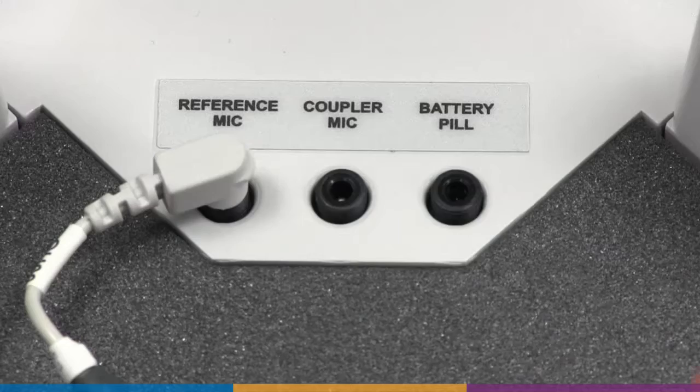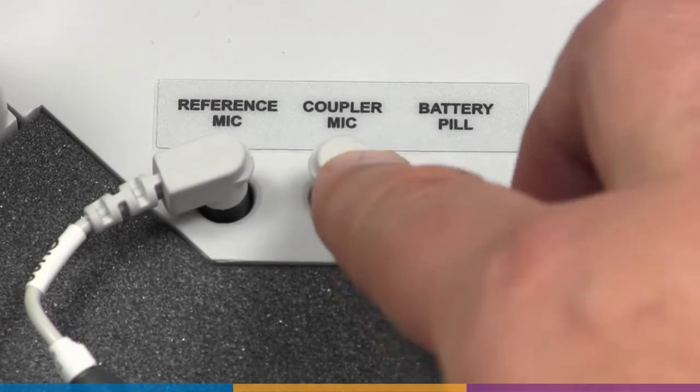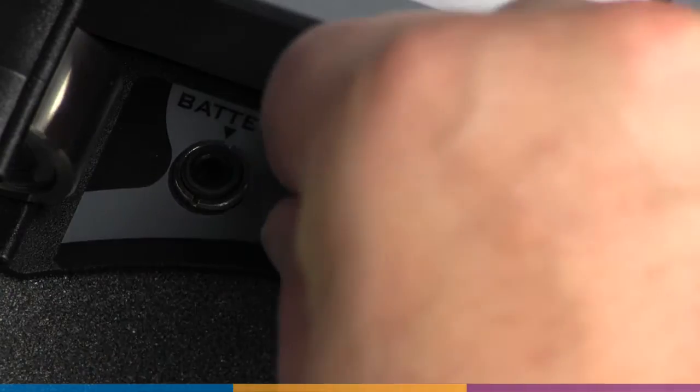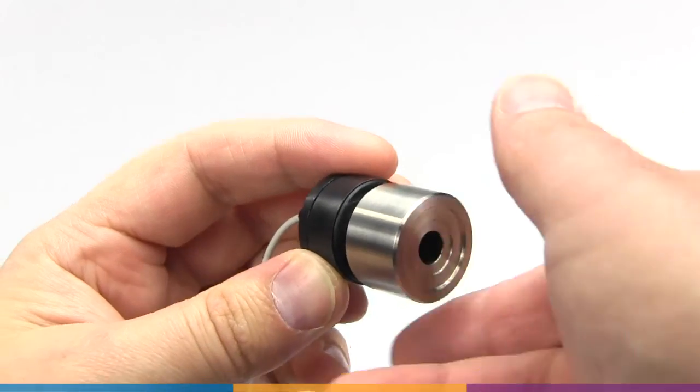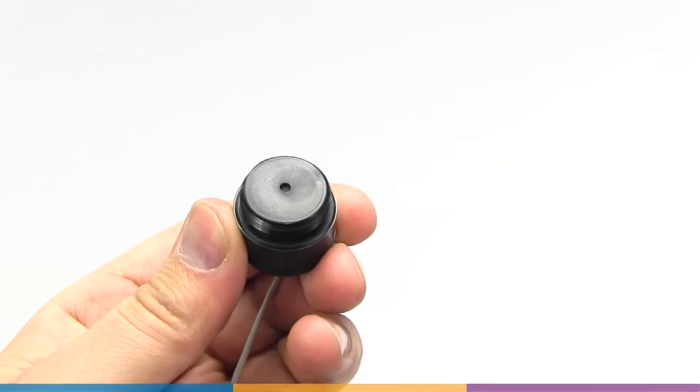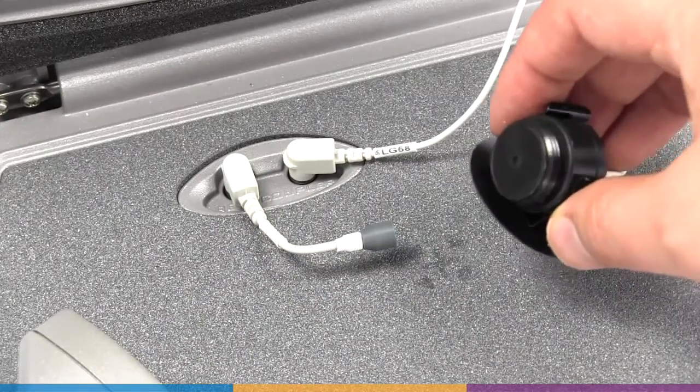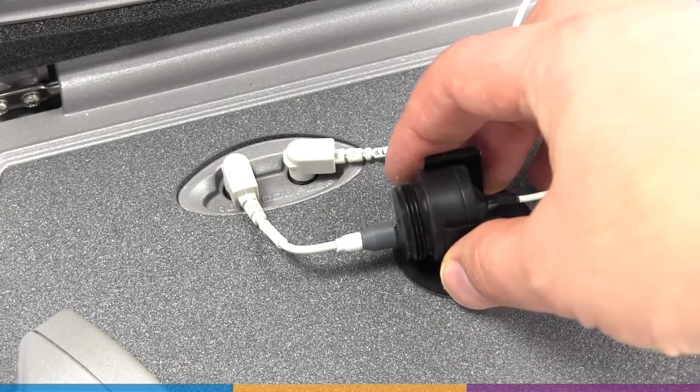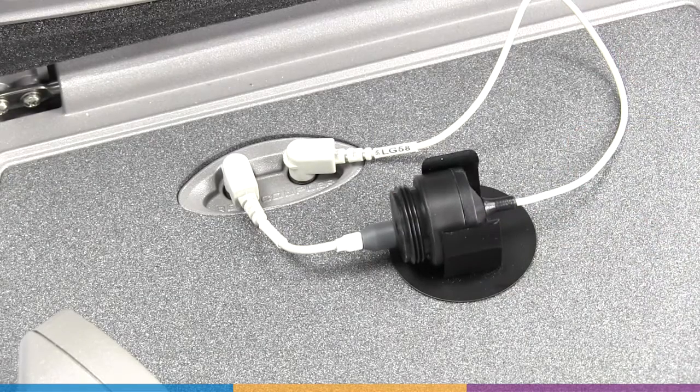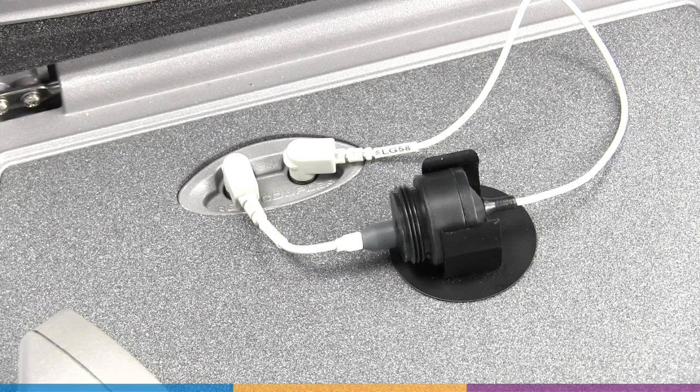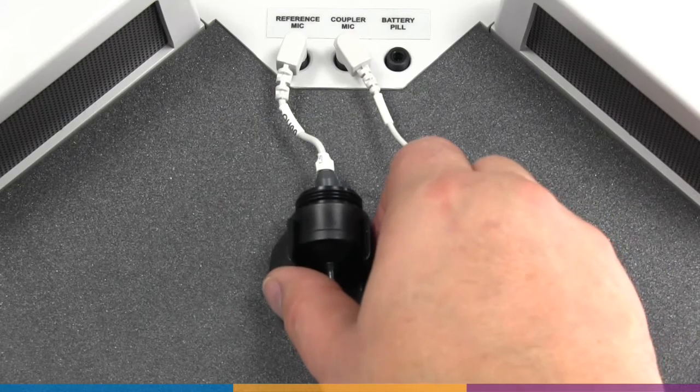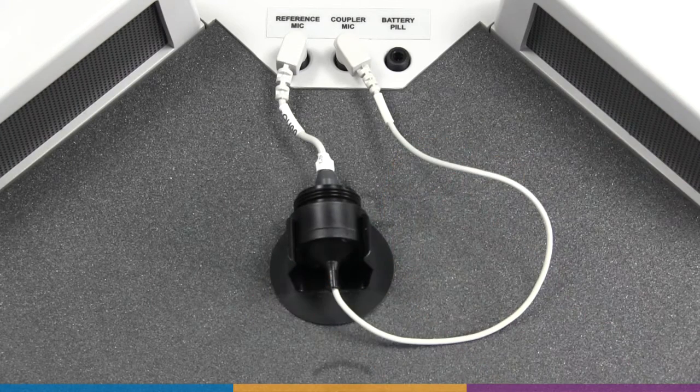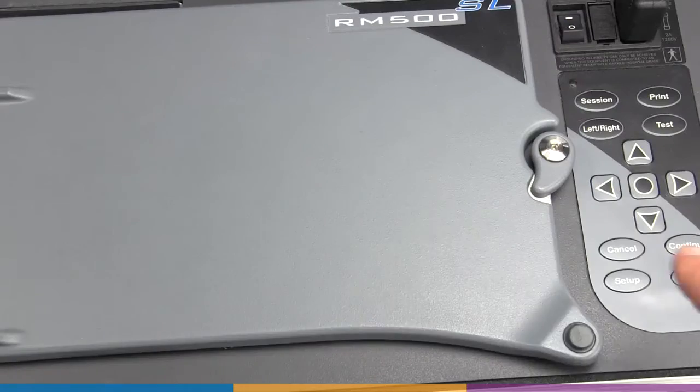If this is your initial setup, see the user guide for detailed, model-specific instructions. Check that there is no coupler attached to the coupler microphone. Position the microphones so that the reference microphone is 1-3mm from and directly facing the coupler microphone opening. It is acceptable for the microphones to touch for all models except Verifit 2.